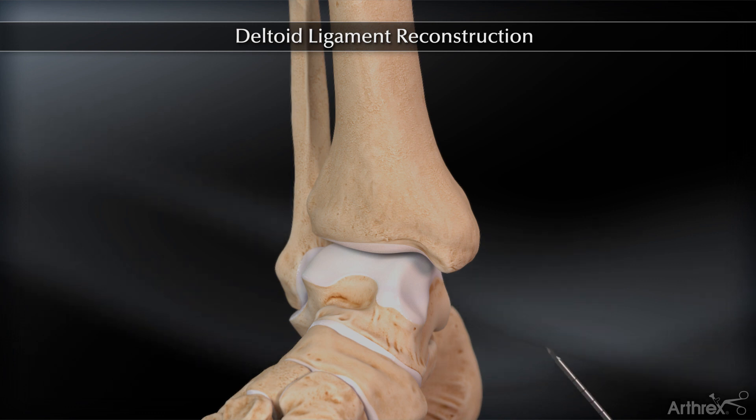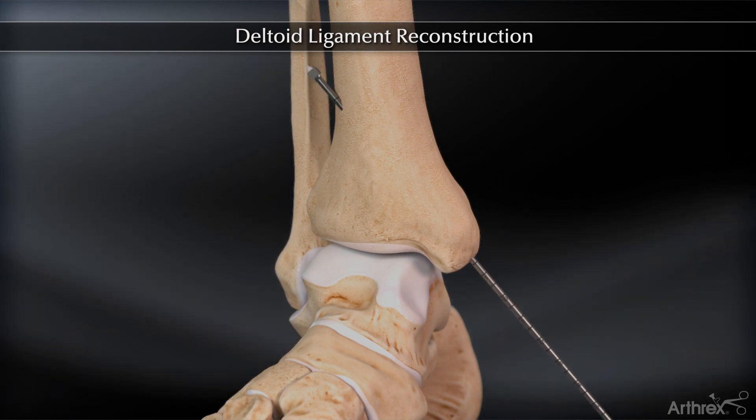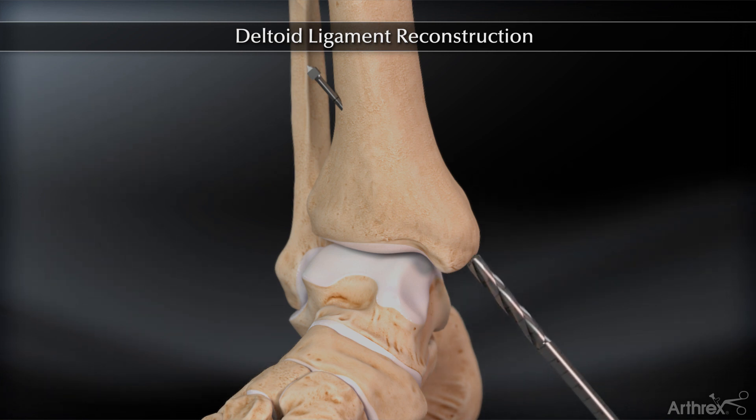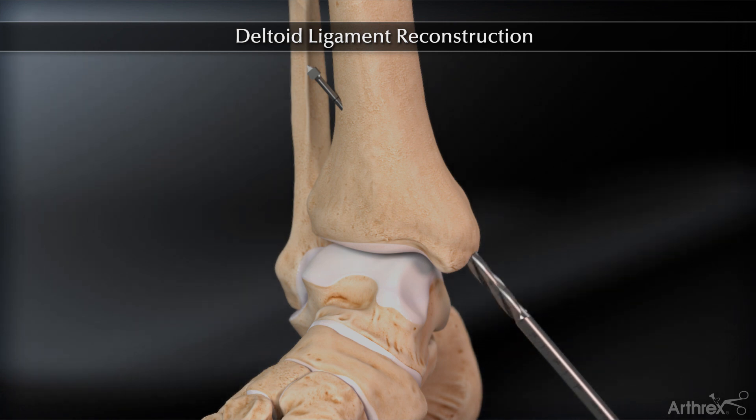Insert the spade tip drill pin into the medial malleolus at the site of the intercollicular groove. The drill pin should be aimed anterolaterally to a point 5-6 cm above the ankle joint and lateral to the anterior tibial crest, exiting the leg anterolaterally medial to the course of the superficial peroneal nerve. The drill pin is overdrilled to a depth of 40 mm. Do not violate the far cortex of the tibia.